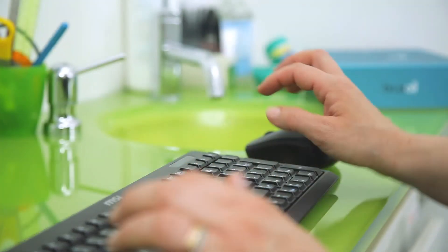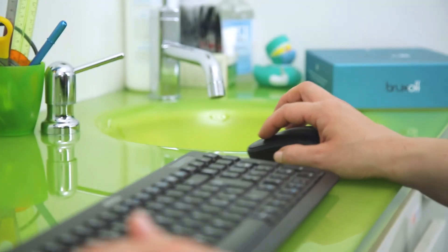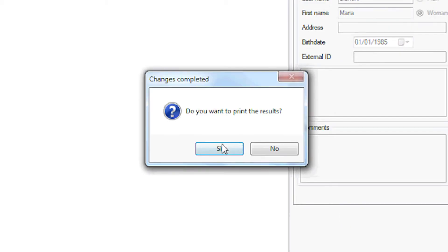At the end of this stage, it is necessary to create a profile with the patient's details before proceeding to print the results.